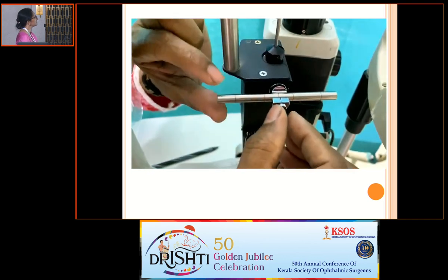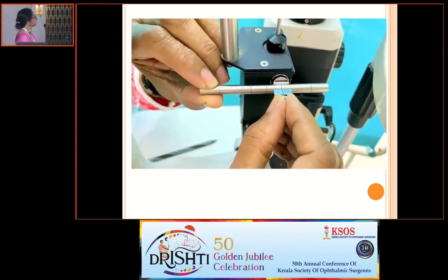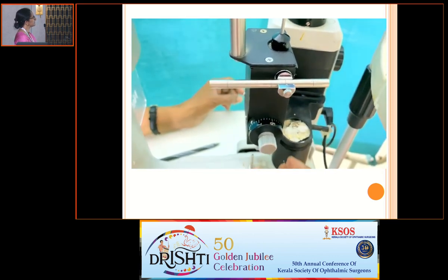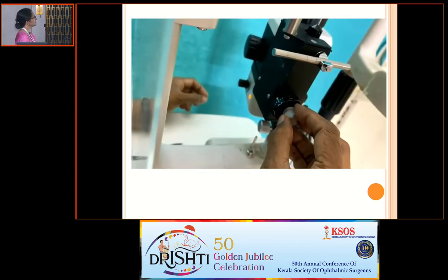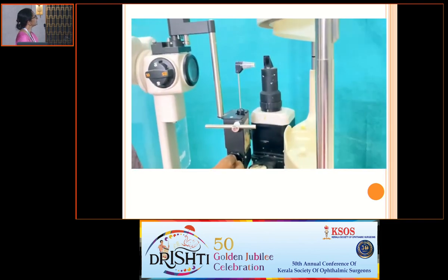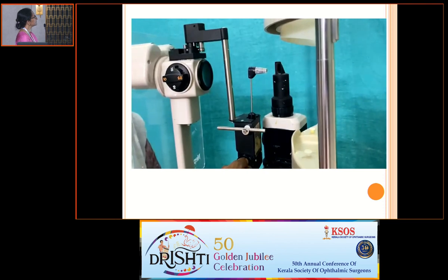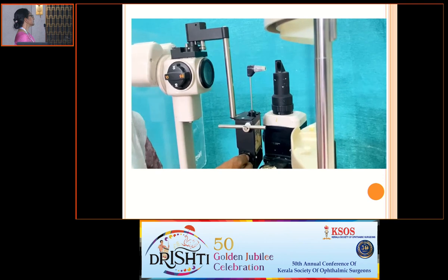Now adjust the weight bar in such a way that the marking corresponding to 20 millimeters of mercury should come in line with the index marking on the adjustable holder. Turn the knob to position 2 and now rotate the knob a little forwards, about 0.5 millimeters of mercury, and we can see a forward movement of the feeler arm and the tonometer head. And now rotate the knob a little backwards and we can see a backward movement of the feeler arm with the tonometer head.